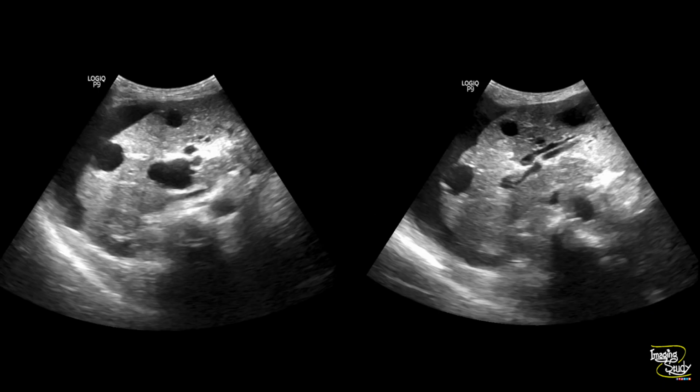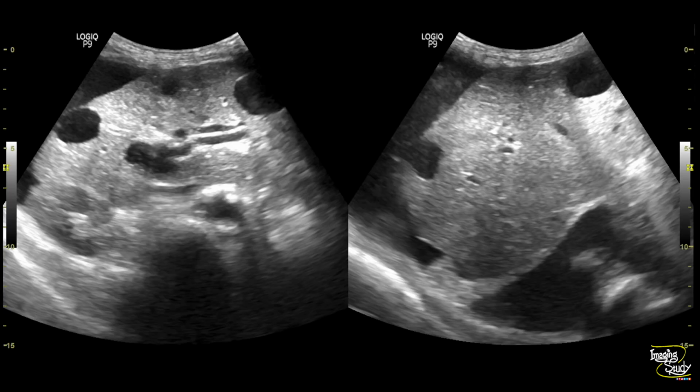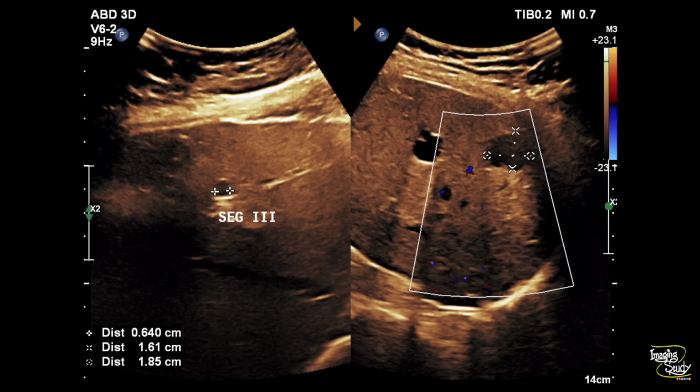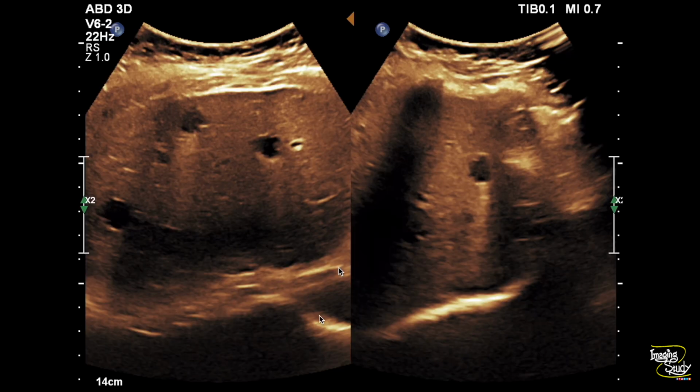Here's the picture of these cystic lesions with chronic liver disease with ascites. Patient also had pleural effusion. Another patient with a bilobed cystic lesion with a fine internal septation. You can see these cystic lesions are scattered within multiple segments with no flow on color Doppler. Here is again these cystic lesions.